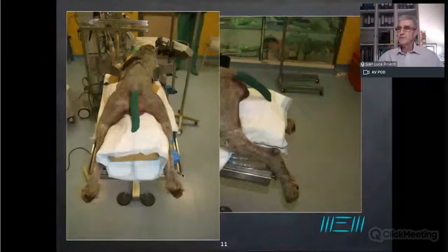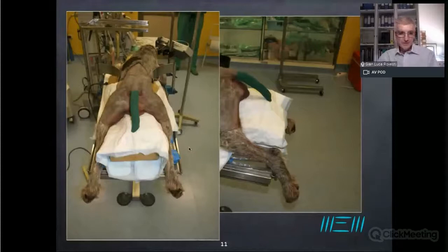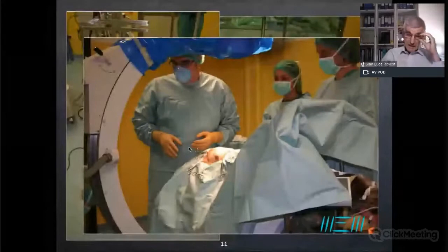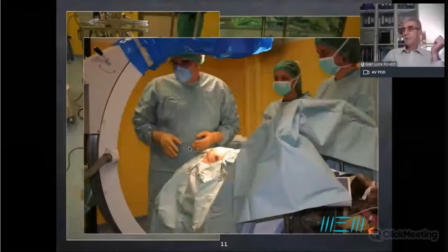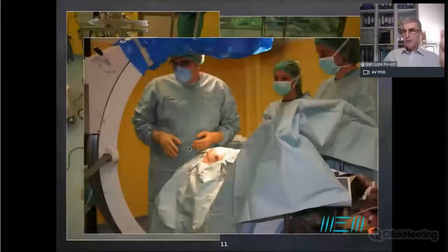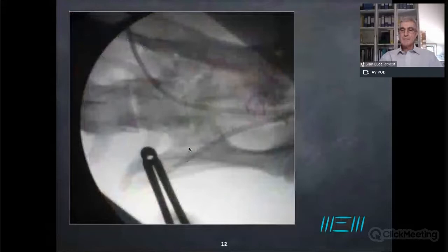And of course, if I can use fluoroscopy intraoperatively, it will help a lot in defining the correct positioning, but I would say not mandatory. Meaning that, of course, if you have fluoroscopy, you can have a good help in defining the positioning, but with good training on the cadaver, for example, you can get a good feeling about where to position the pins without fluoroscopy, because the landmarks are easily accessible. Okay, easily accessible. So, first landmark, as we mentioned, iliac wing.